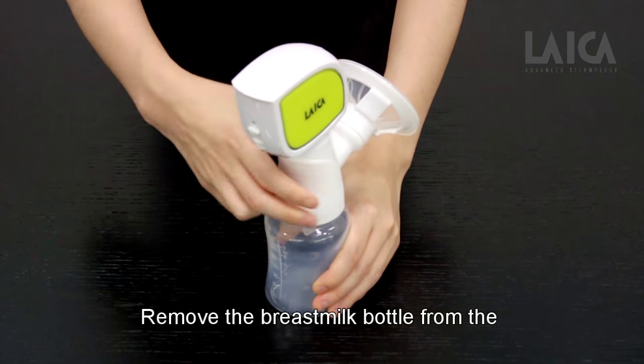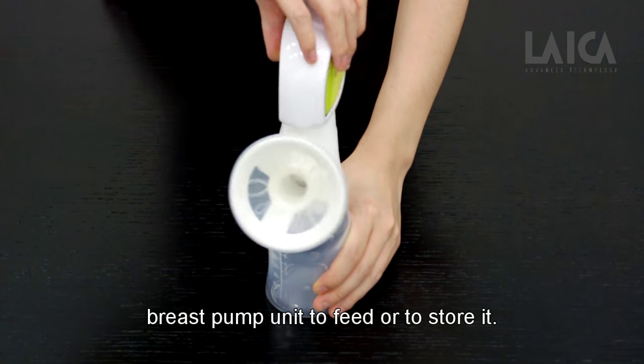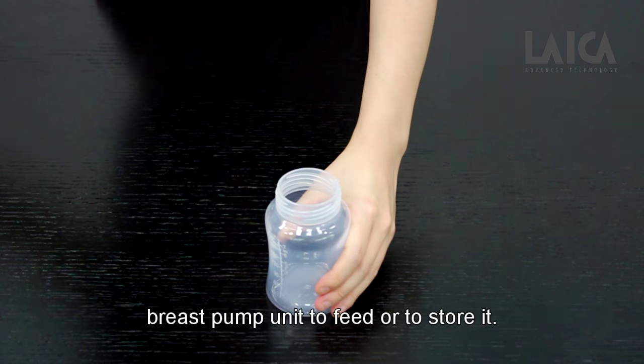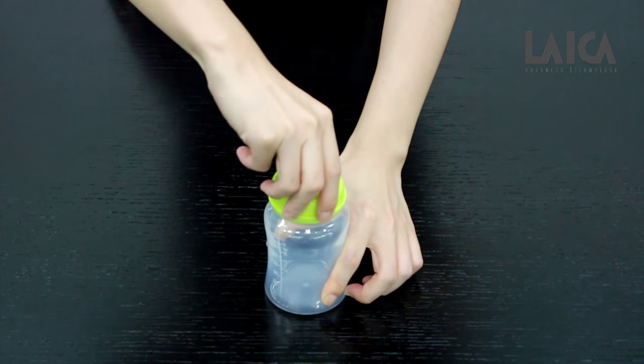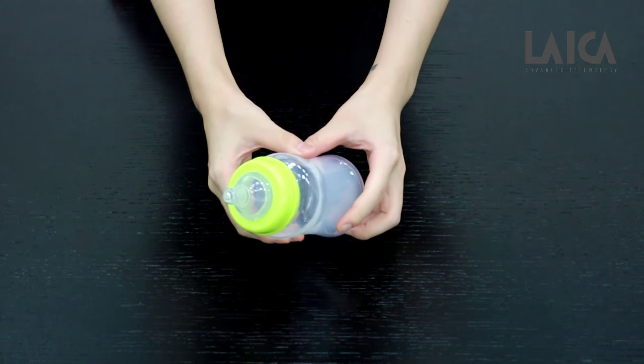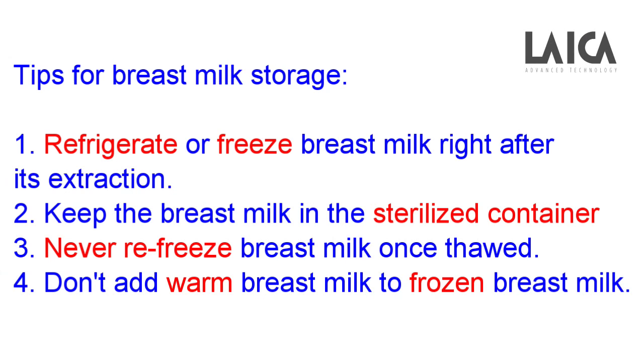Remove the breast milk bottle from the breast pump unit to feed or to store it.